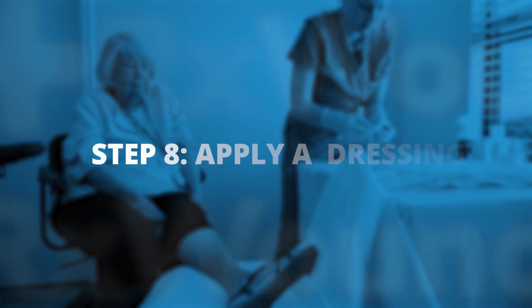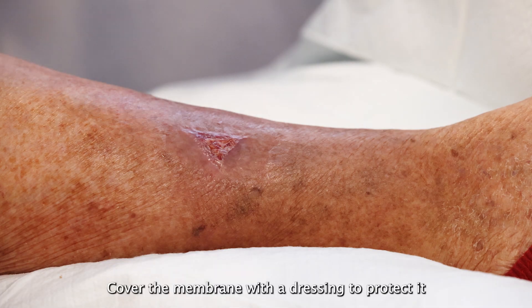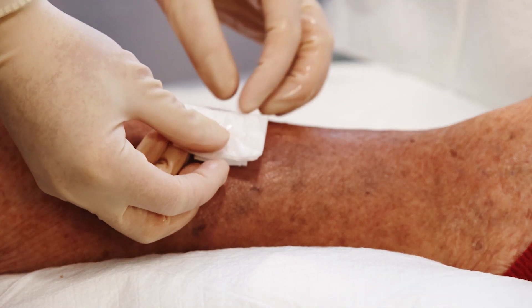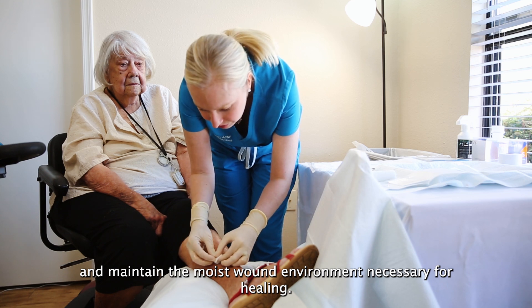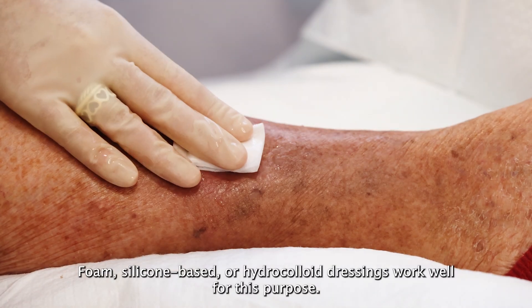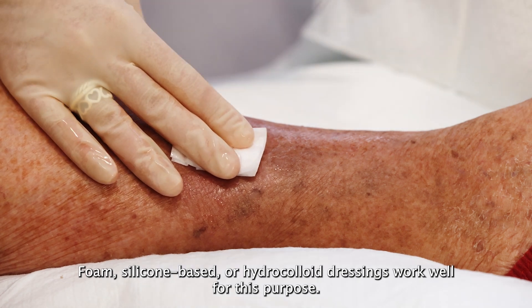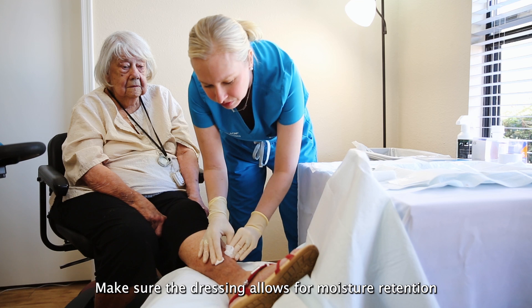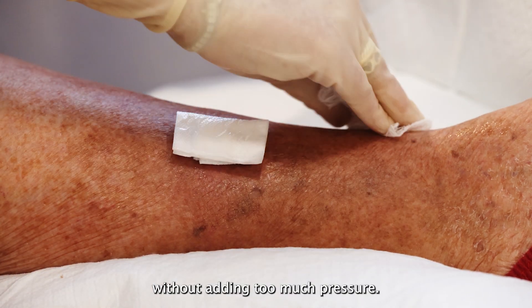Step 8: Apply a dressing. Cover the membrane with a dressing to protect it and maintain the moist wound environment necessary for healing. Foam, silicone-based, or hydrocolloid dressings work well for this purpose. Make sure the dressing allows for moisture retention without adding too much pressure.